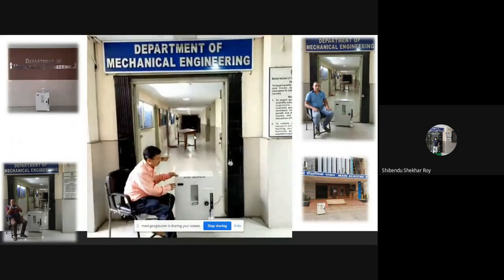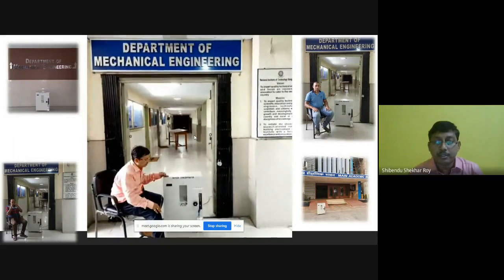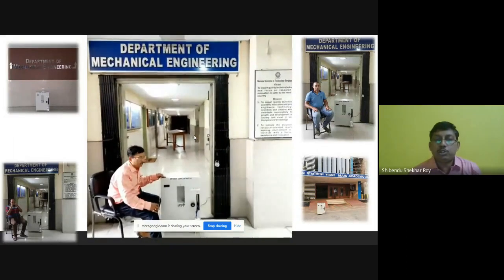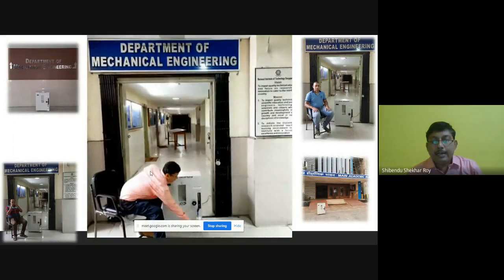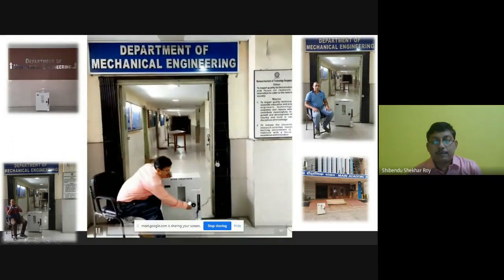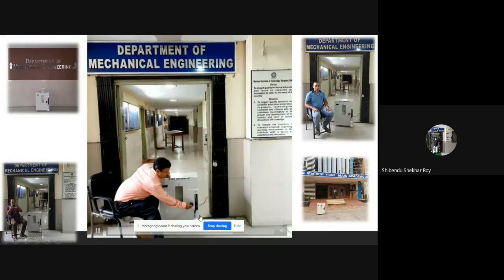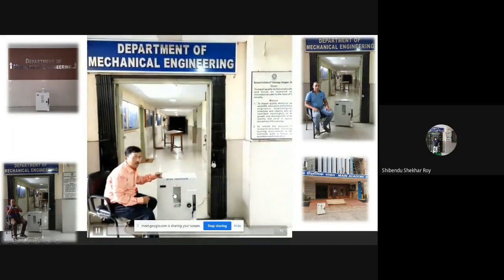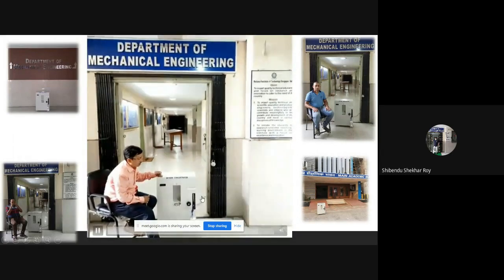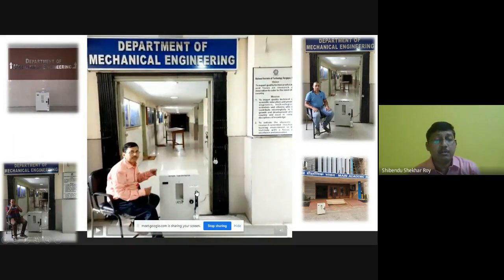Here, as I already mentioned, the technology is PSA, with a specific grade of zeolite chamber. Zeolite is used to absorb the nitrogen, and most of the components used here are developed in India. The intake is air, and after the nitrogen is absorbed, the oxygen-enriched air comes out through a humidifier to the nasal pipe. We can control the discharge or flow rate from 1 liter per minute to 5 liter per minute in this particular model.